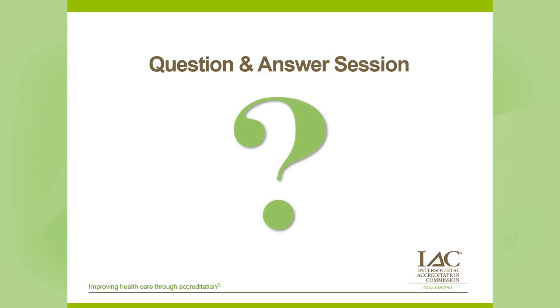That's a great question. So here, nobody has come down hard on that, and that's why this is so challenging. A lot of this lets you see how people practice at different institutions. My approach at my institution is I look for mounting evidence. The first thing I look at is, is there a delayed T1/2? Is it slow to emptying out a collecting system?